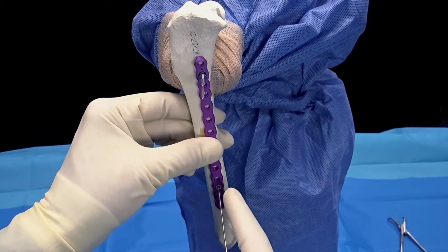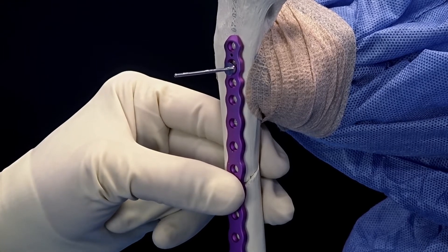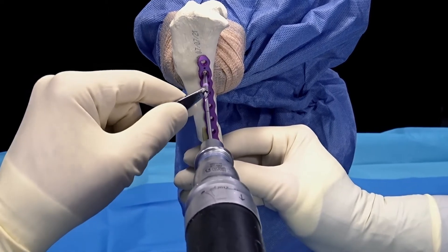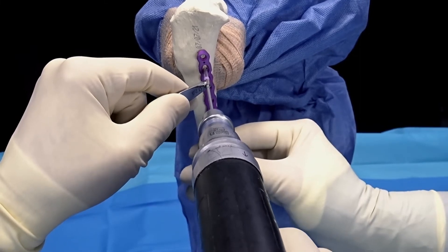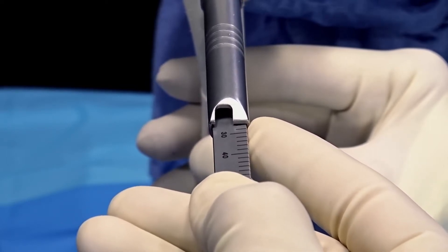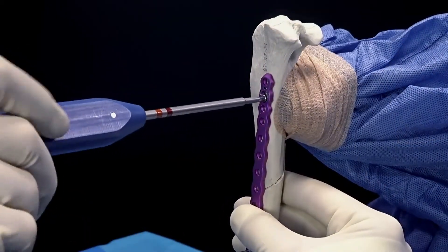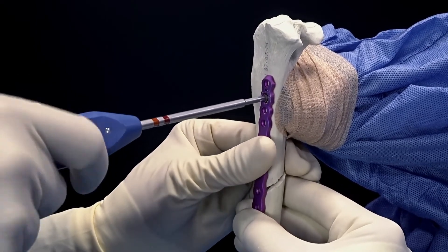We've placed a K-wire in the cannulated bending plug distally, and now we're going to place a cortical screw in the slide hole. We'll pull our BB-TAC and drill with a 2.3 millimeter drill bit in the standard drill sleeve bicortically. Once drilled, the depth gauge is used to measure the hole — in this case we're measuring a 26 screw, so we'll place a 28. Just prior to tightening, we're able to get a fine adjustment using the slide hole to then apply the plate to the bone.